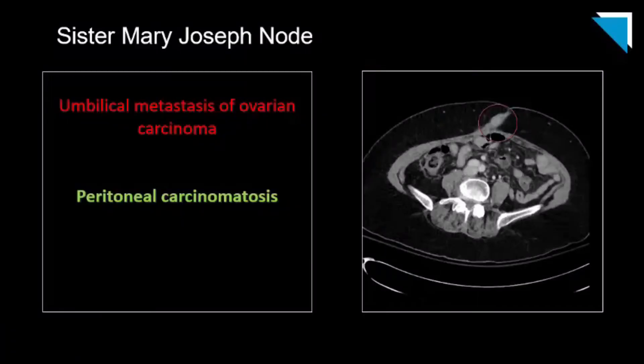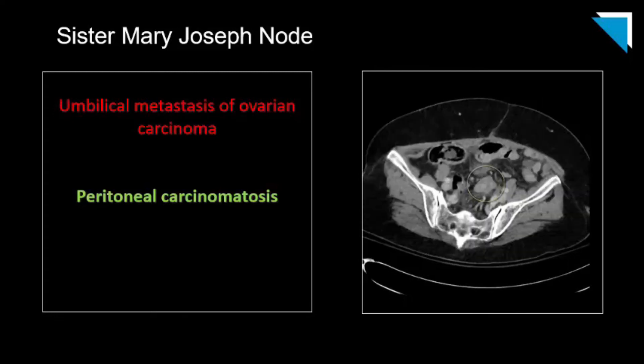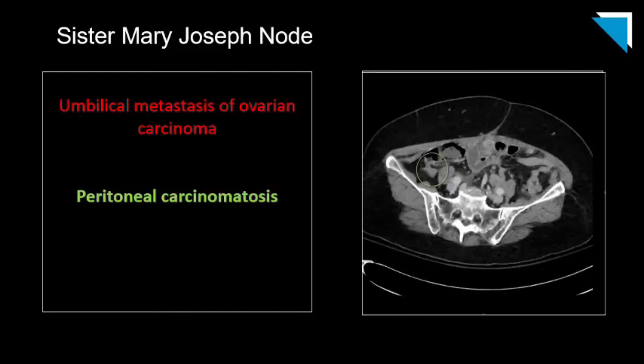Here is a patient with an enhancing umbilical mass, shown outlined in a red circle. When reading this case, this was the first thing that jumped out suggesting a history of malignancy — no history of malignancy was initially provided, making this an important discovery. Once this finding was made, all these other peritoneal implants started to jump out, like these in the left lower quadrant and here in the right lower quadrant.